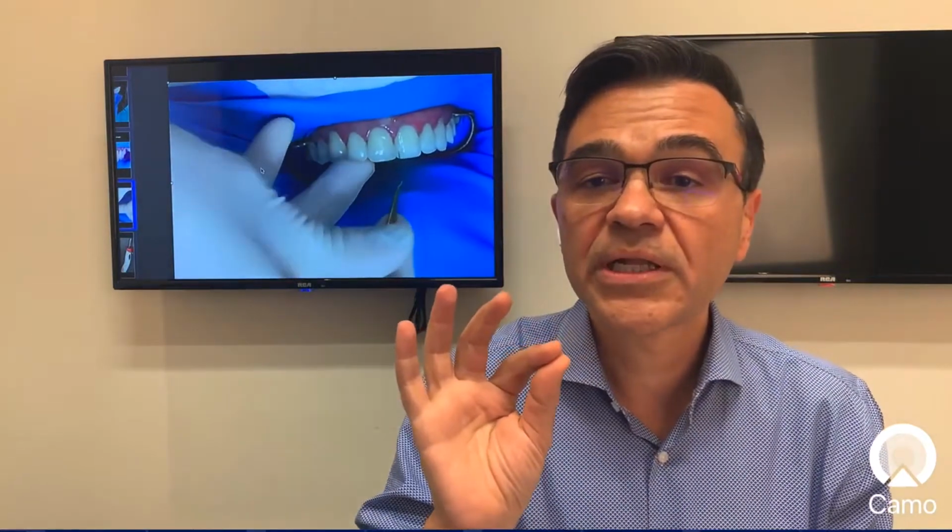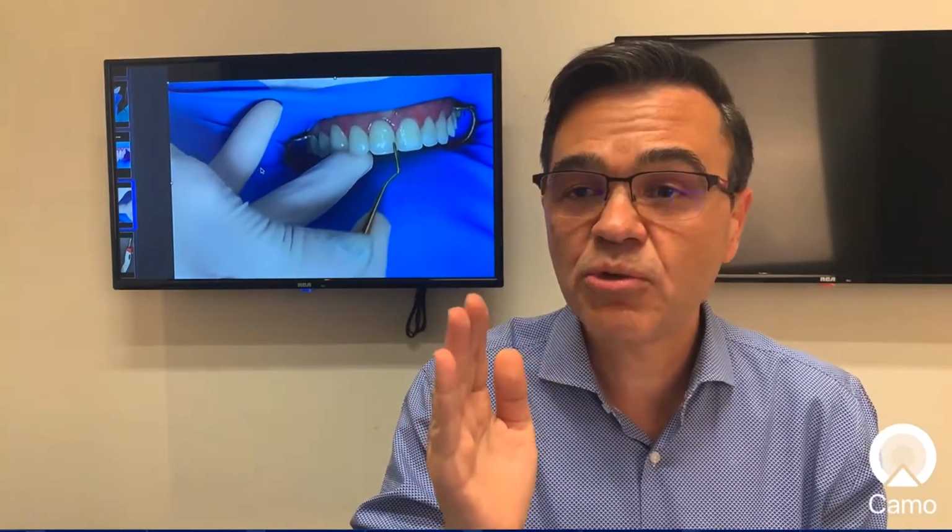You cannot put it in the mouth and expect to become something. You have to do it in your fingers with very clean gloves and then put it in the mouth, okay? And then you put it on the Mylar strip. And as you can see there in the video, you pull lingually. And then that composite will go in between each tooth.